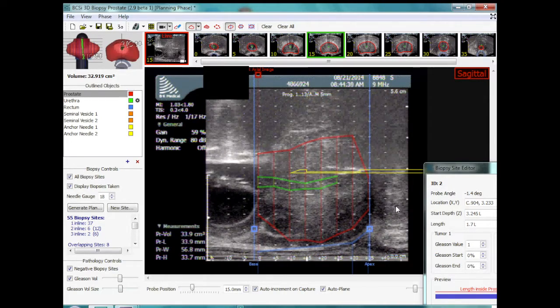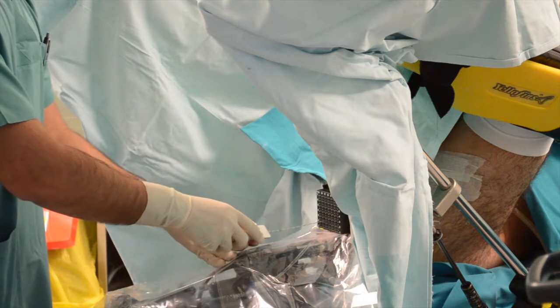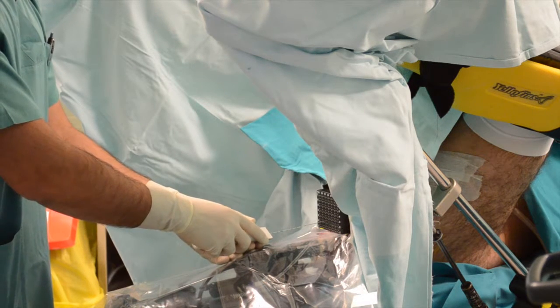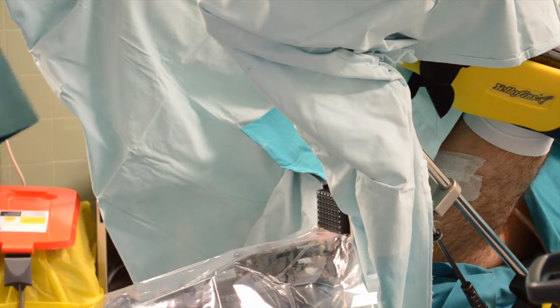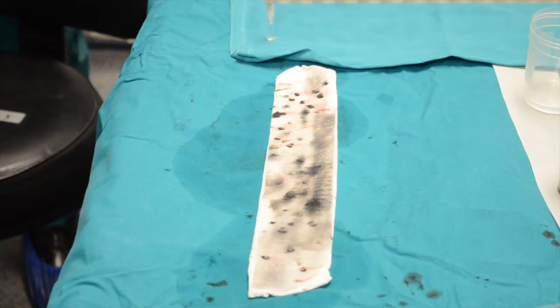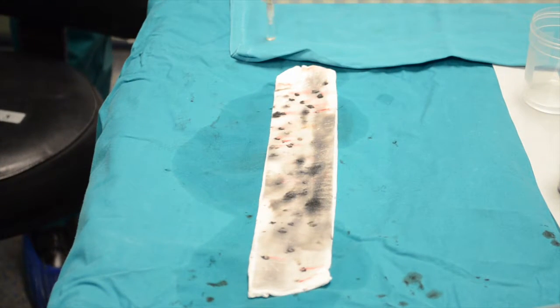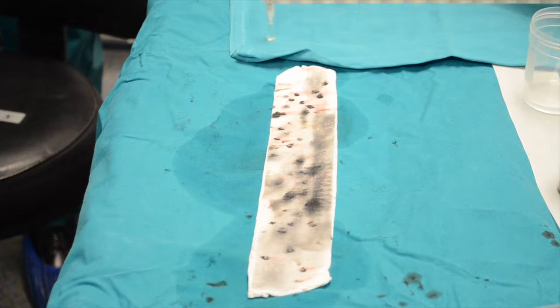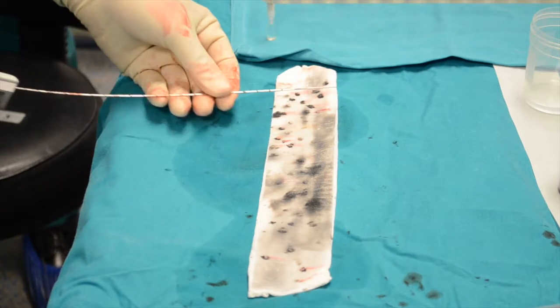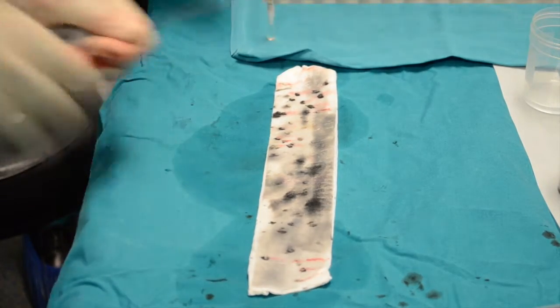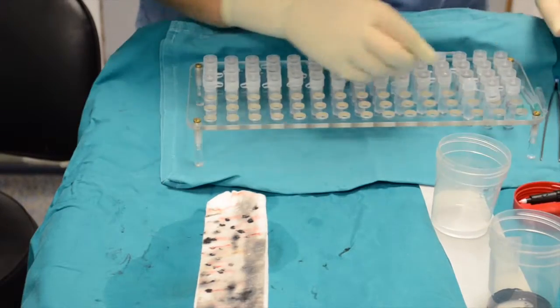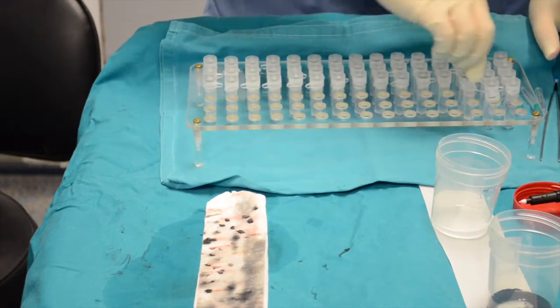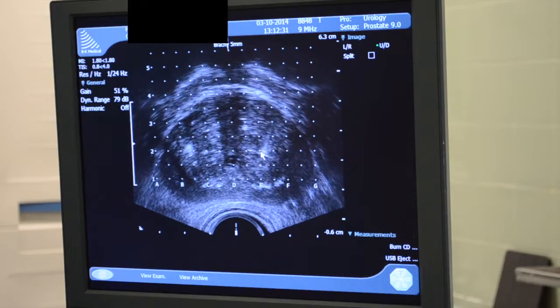After the sample is taken, the urologist removes the needle gun from the patient and brings it over to the side table. The sample is put on a TELFA or other media and Indian ink needs to be applied to the tip of the sample to allow the pathologist to identify its apical end.